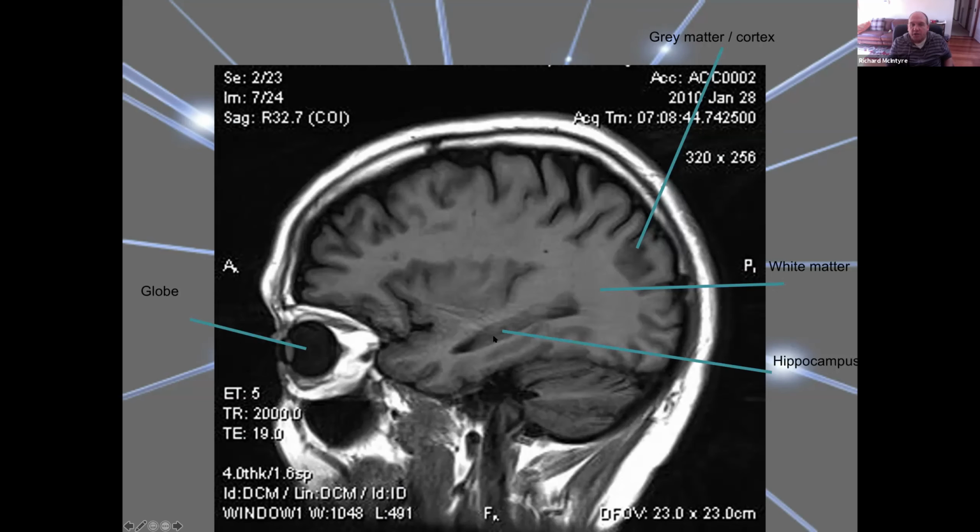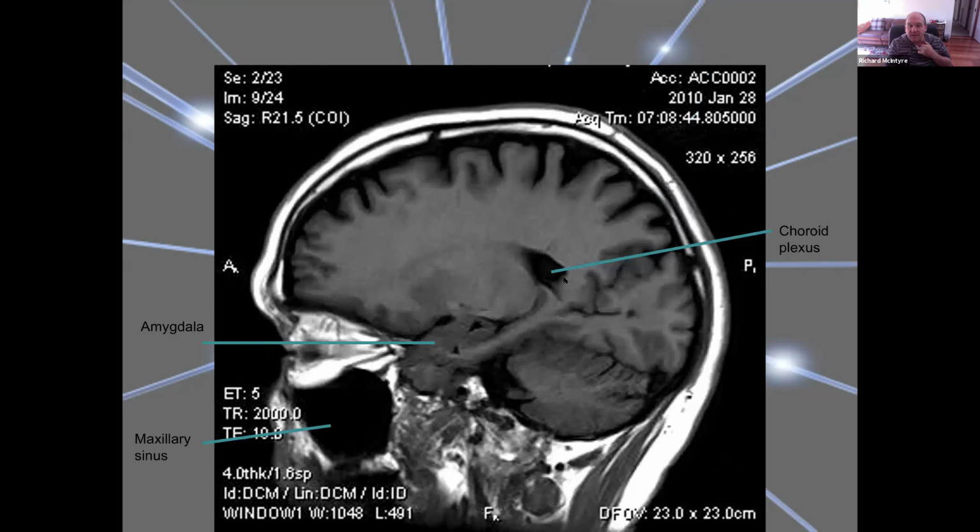Hippocampus is a really important structure on the temporal imaging. Okay. And that's involved with memory. Okay. So, and it's bilateral, so you see it on both sides of the brain. We come into our choroid plexus, so we can just see our choroid plexus there. Okay. It might be calcified. It probably is calcified. We're not going to see it on MRI scans, unless it's full of fluid, in which case we will see it on T2 weighted scans.